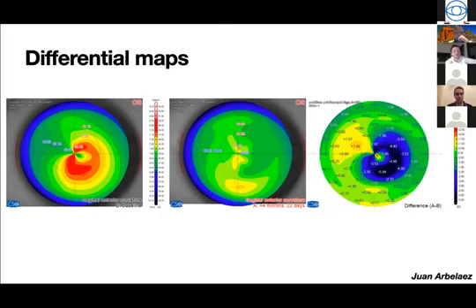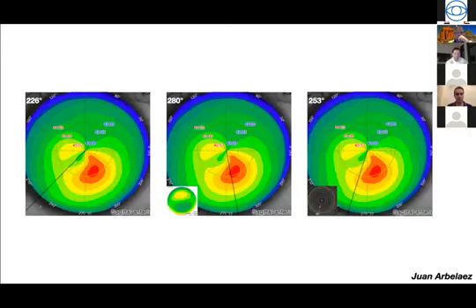the ring is thicker. It's important to understand when we are implanting rings that we know that the ring effect will be greater when the ring is thicker. It will be greater when the arc length of the ring is longer, and it will be greater also when we implant this ring in a smaller diameter. Also, if you implant this ring shallower, it will give you also a little bit of a greater effect.